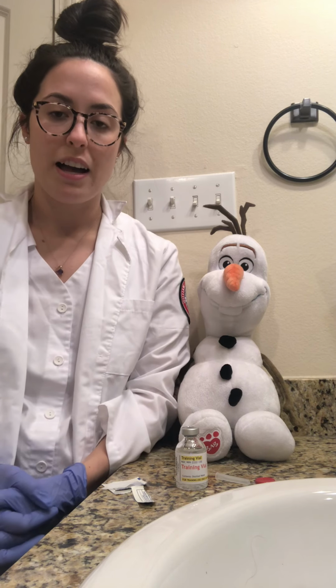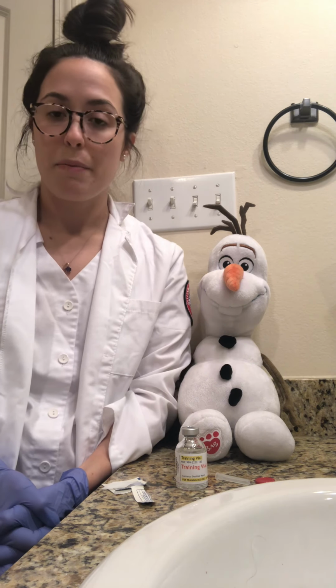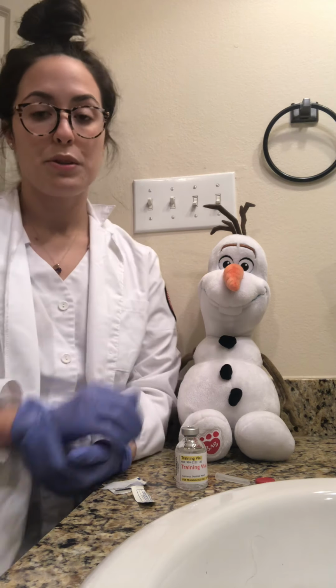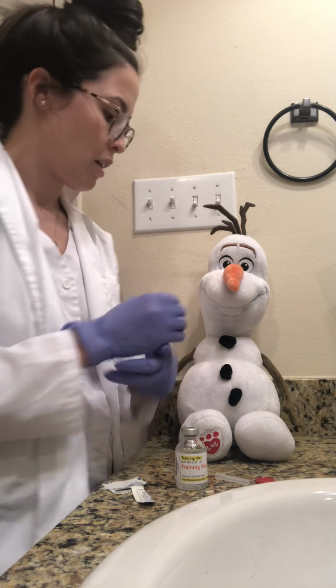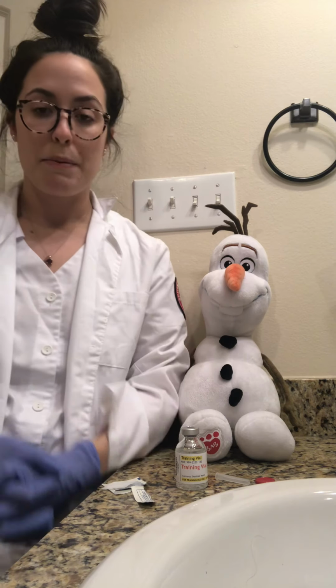Teaching you how to give an IM injection to a patient, Mr. Olaf here. Before administering the medication, or any medication for that matter, we want to make sure that we verify the 6 rights. First is the right patient. So I'm going to get Mr. Olaf to verify his name and date of birth before I administer the medication. Mr. Olaf, can you verify your name and date of birth for me? Okay, great. The name and date of birth is correct.